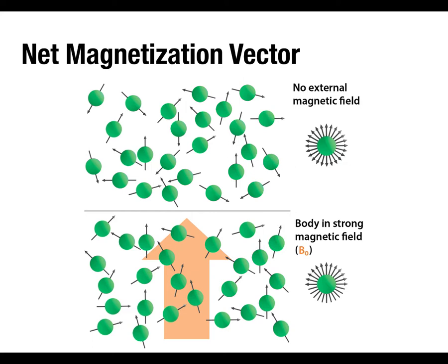But a strong magnetic field like an MRI scanner, with a field that's always on, will have a weak tendency to pull these protons into alignment. And the stronger the magnetic field, so the stronger the scanner, the stronger that tendency is. So that's part of where having a 3 Tesla or a 7 Tesla MRI is better than a 1.5, is it's pulling more of these protons into alignment with it.